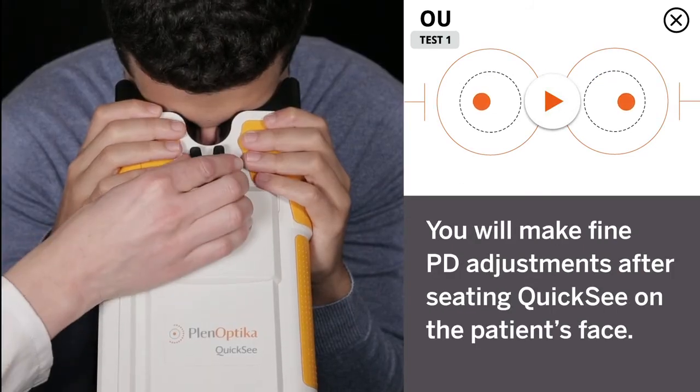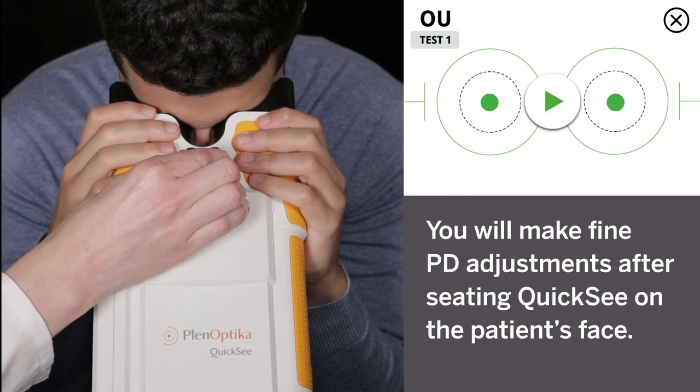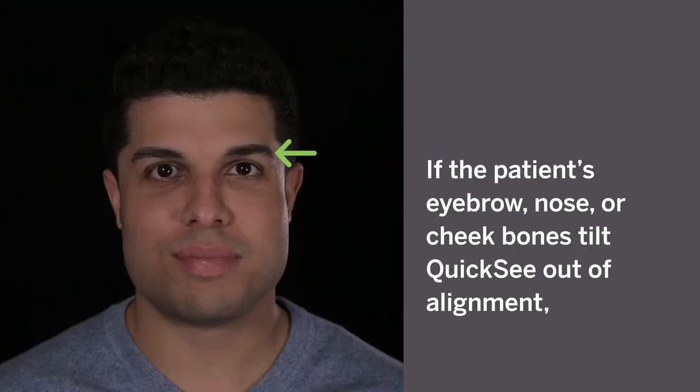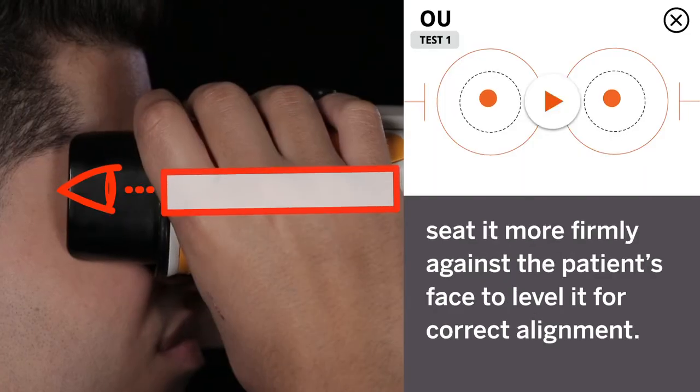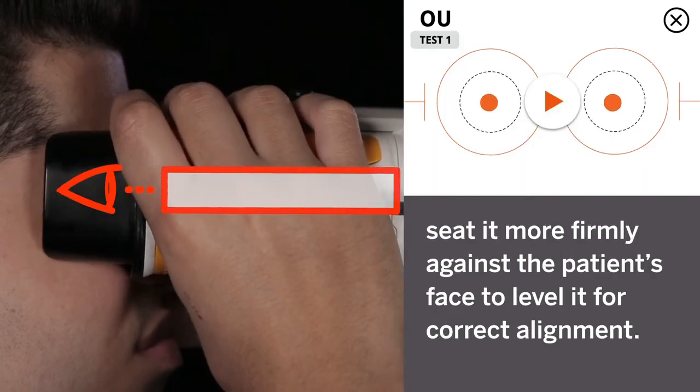You will make fine PD adjustments after seating QuickSee on the patient's face. If the patient's eyebrow, nose, or cheekbones tilt QuickSee out of alignment, seat it more firmly against the patient's face to level it for correct alignment.